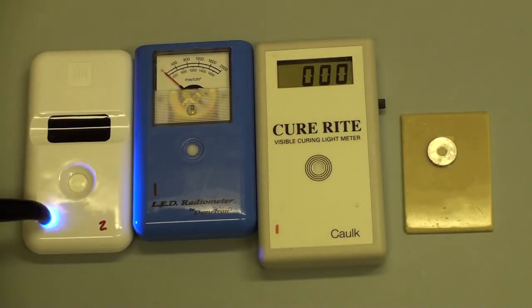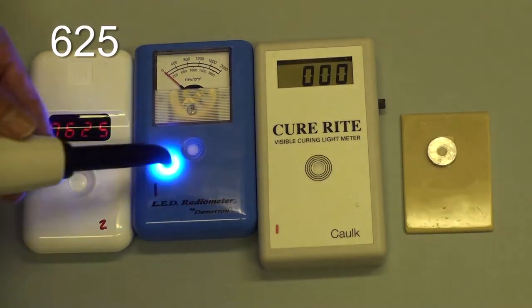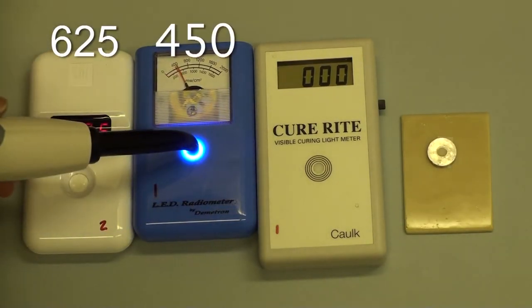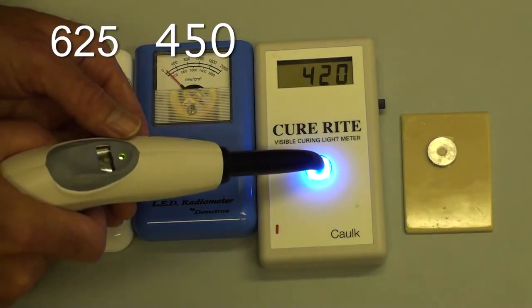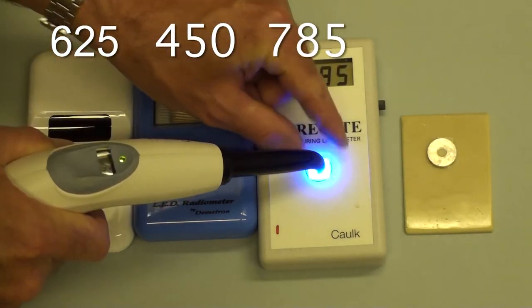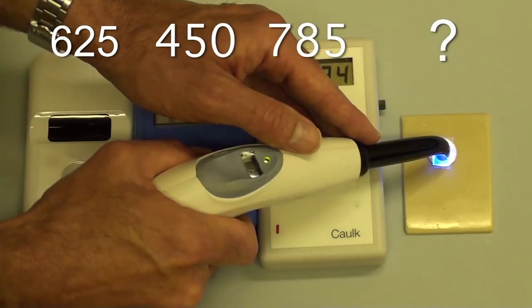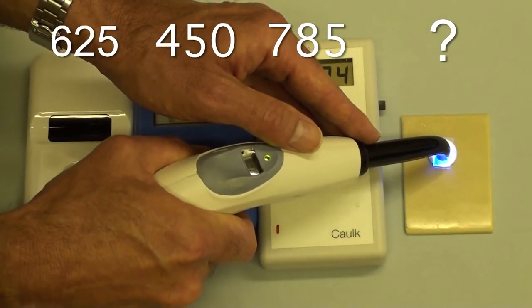Much of dental research has used dental radiometers to record the radiance received by specimens. Unfortunately, dental radiometers are inaccurate. As we can see here, the same curing light used on three different radiometers gives three very different irradiance readings. Which one is correct and how much irradiance is being received by your specimen?